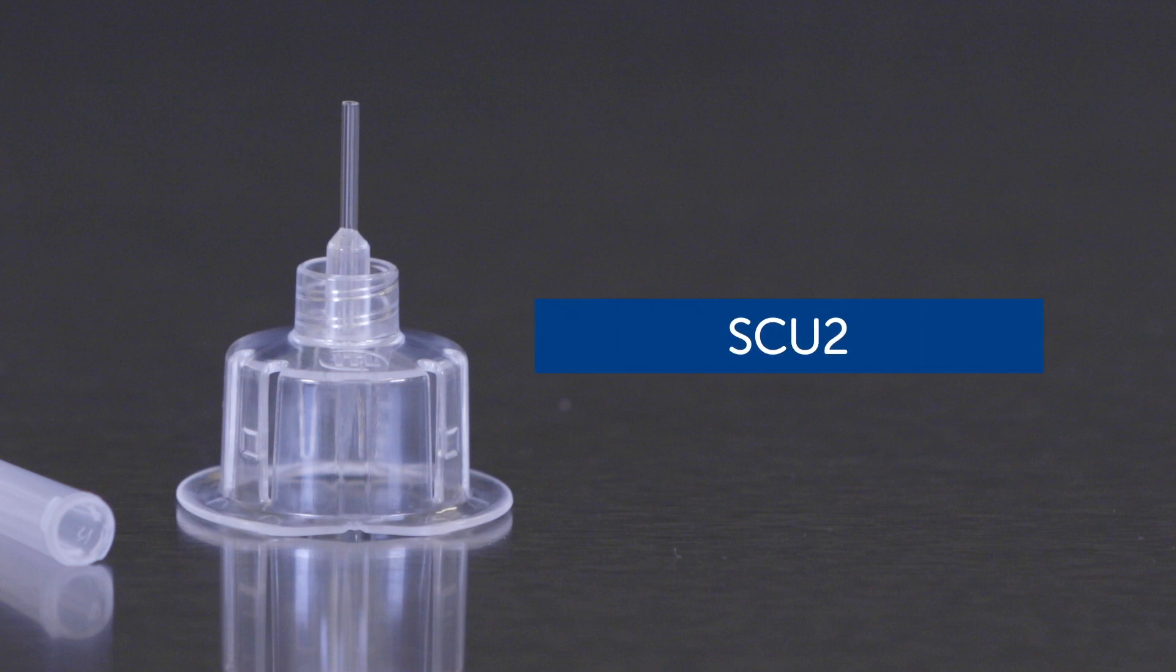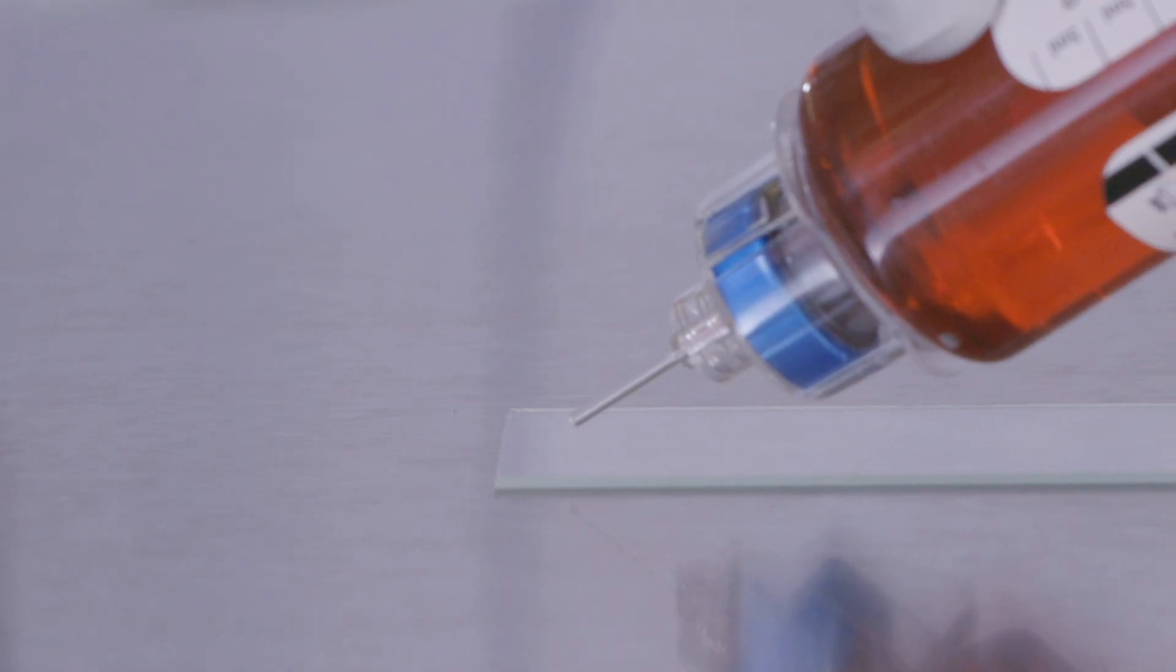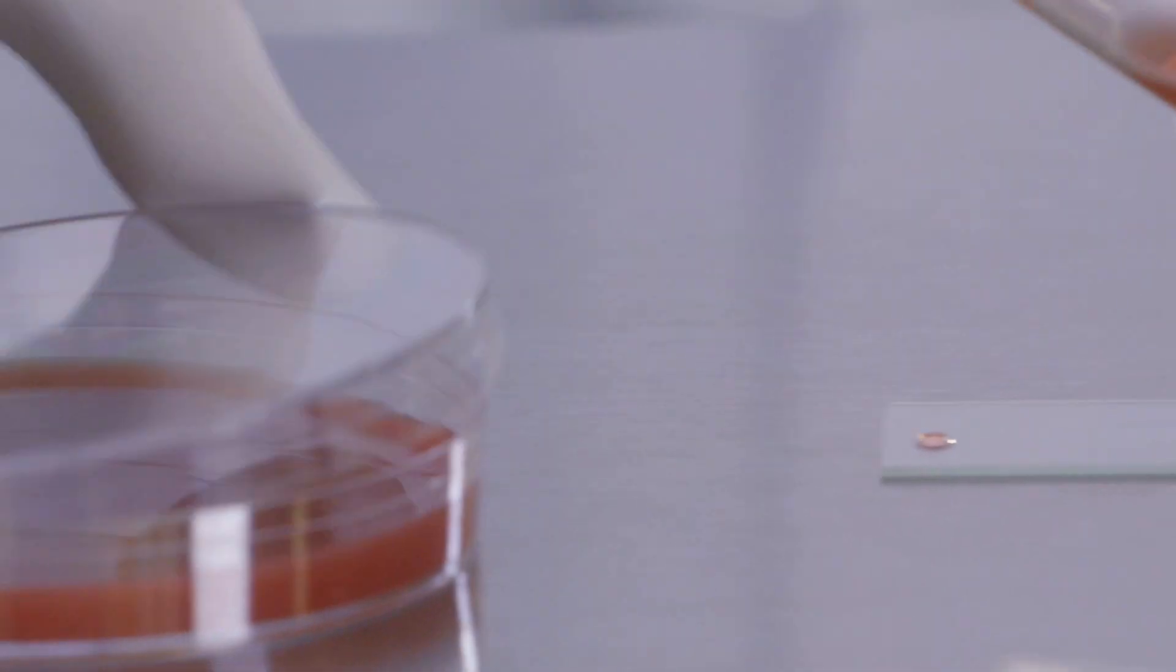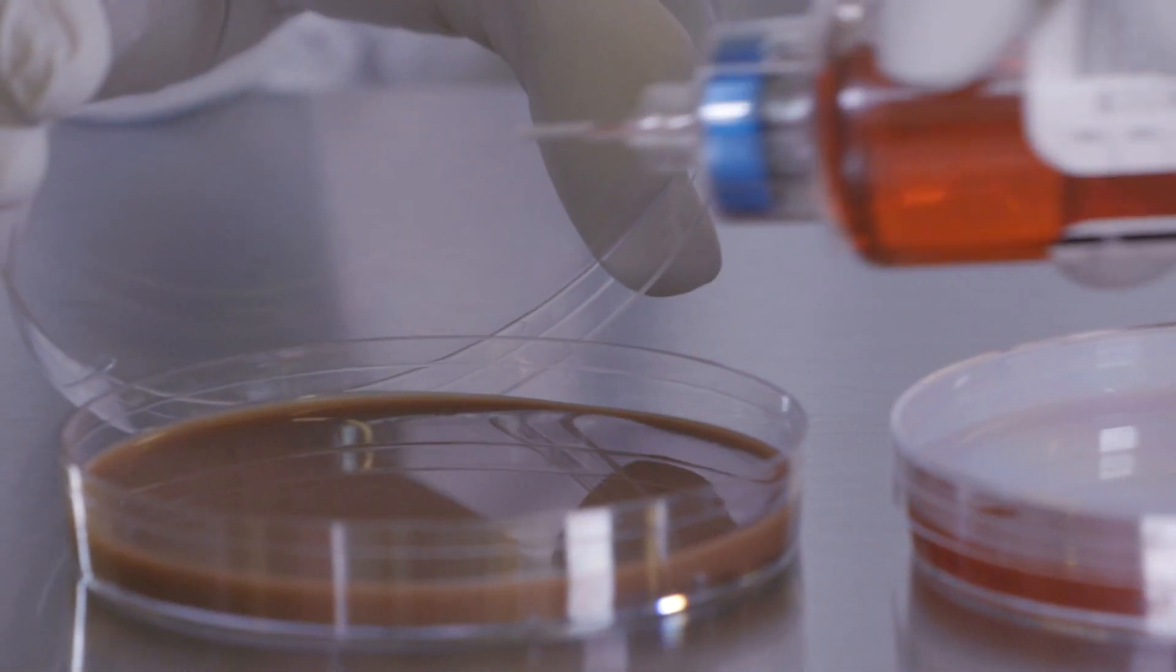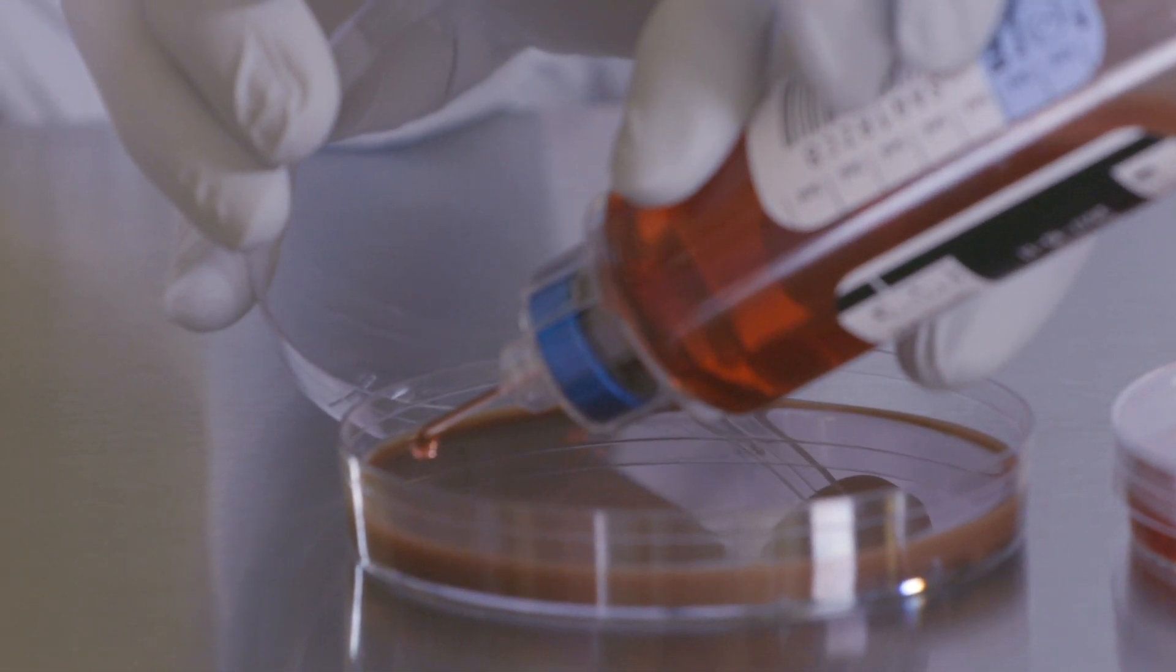SCU-2 is used for applications that require obtaining a sample from a blood culture bottle, such as slide preparation for gram stains, subculture of sample onto media plates, or other tests that require one or multiple drops of sample.